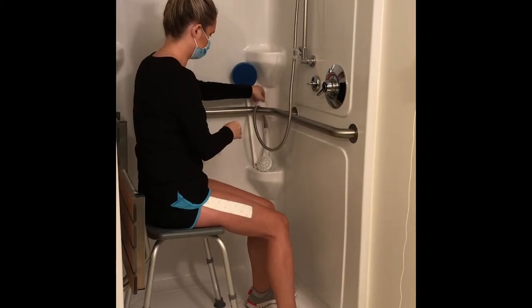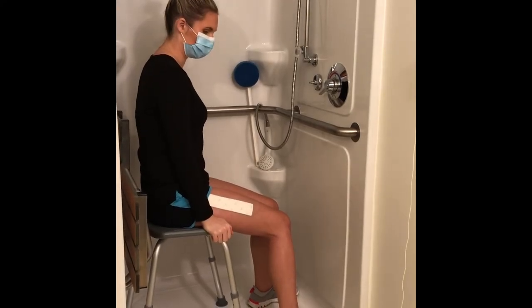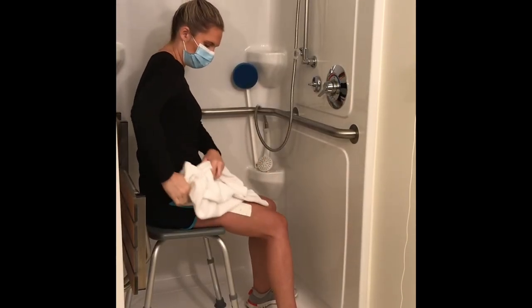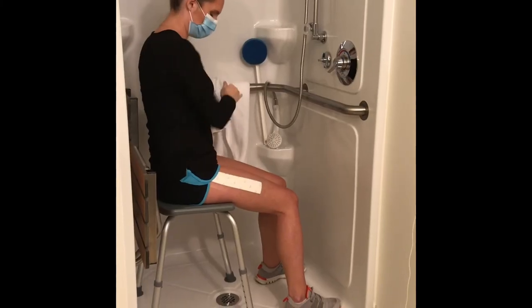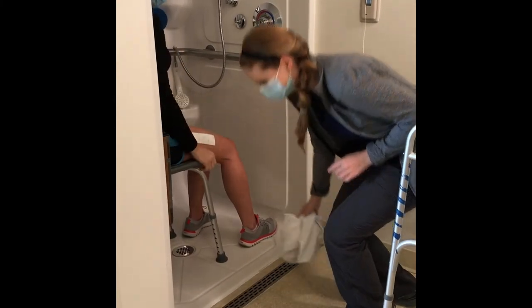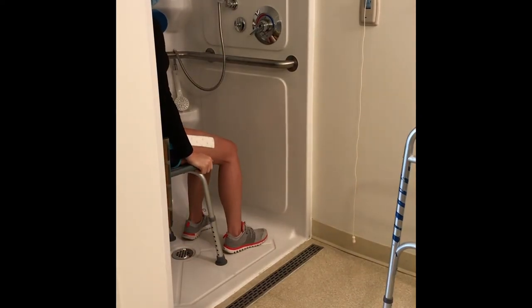Before getting out of the shower stall, dry off as much as possible while sitting down. Pat the incision and bandage dry. Ensure the ground outside of the shower stall is dry to avoid slipping. Stepping on a non-skid mat is helpful for your safety.